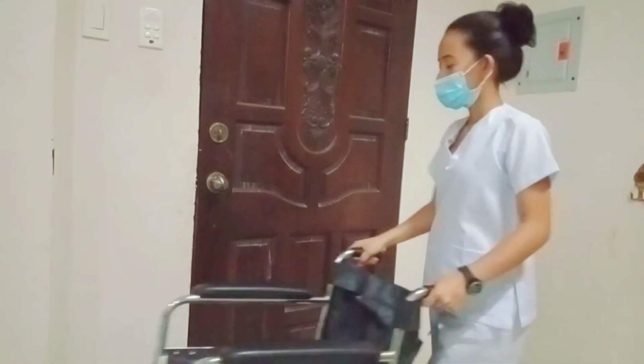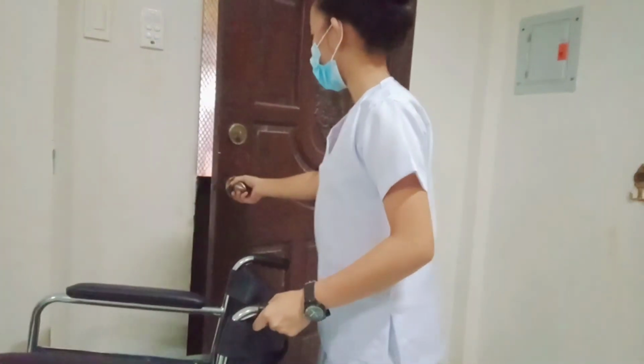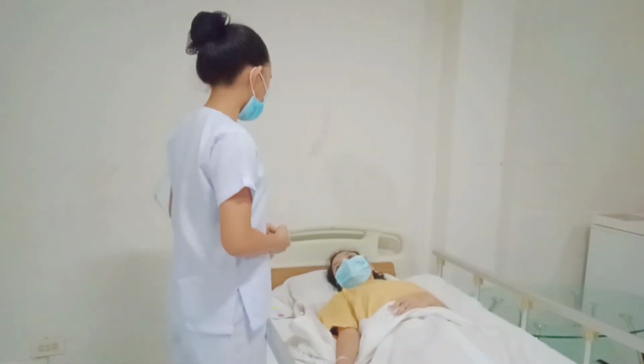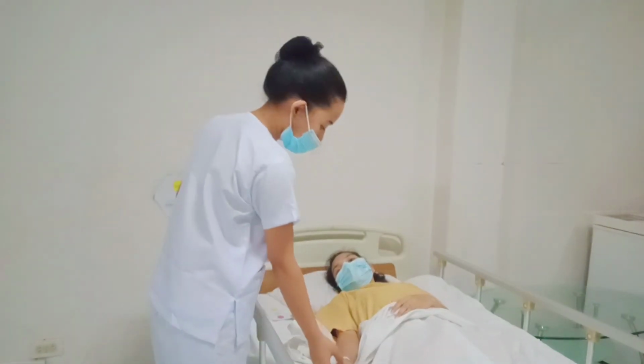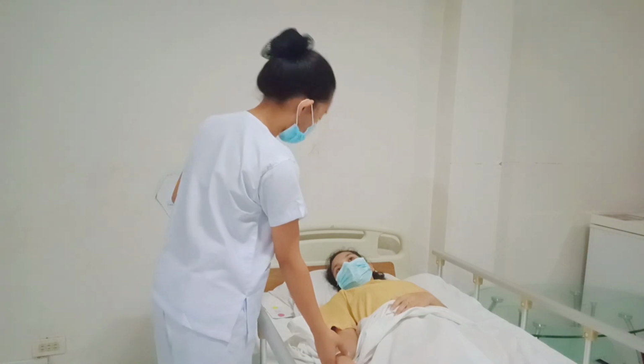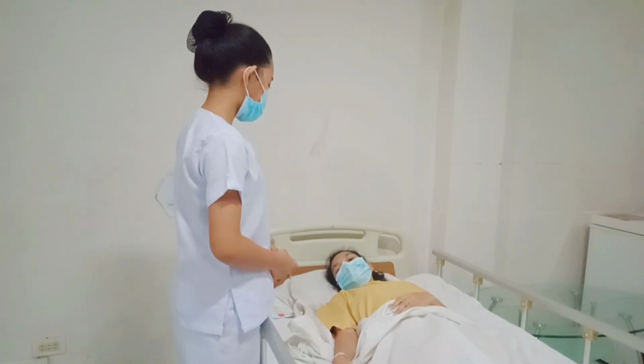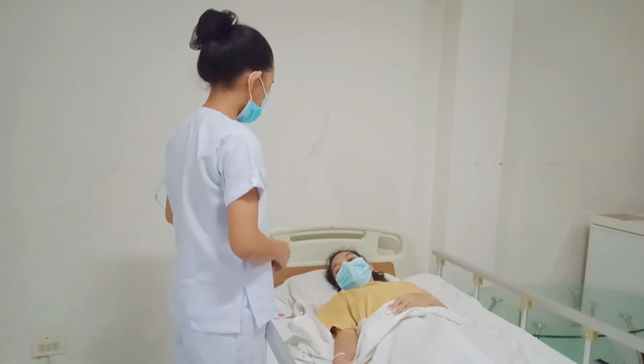Come in. Good morning, ma'am. I am Rachel May Morales, and I will be your student nurse for today. May I check your wristband, ma'am? Can you please state your full name and your date of birth? Okay, ma'am. Sounds good. Assess the client's need, plan modification of usual procedure, and discuss plan with the client.